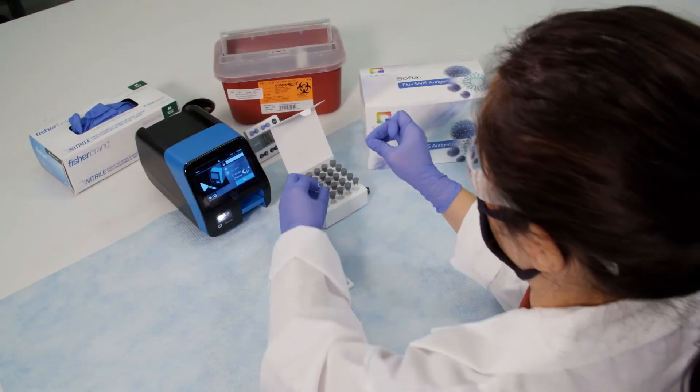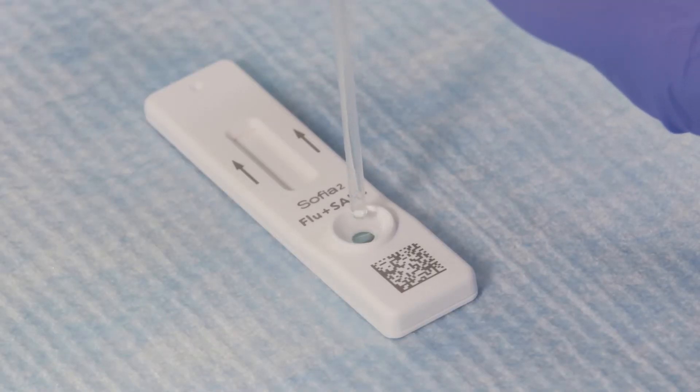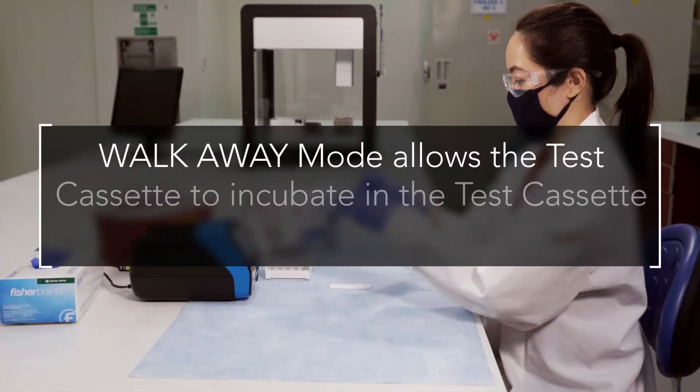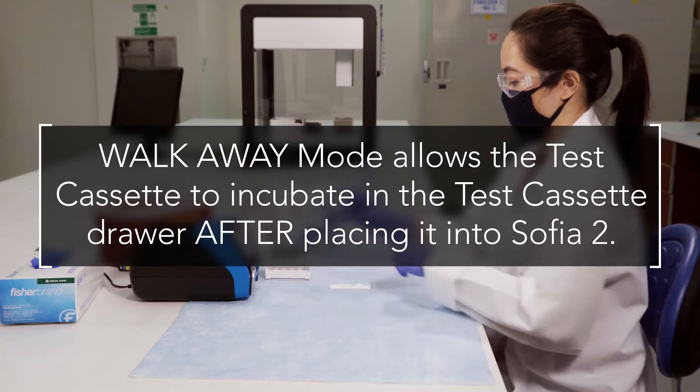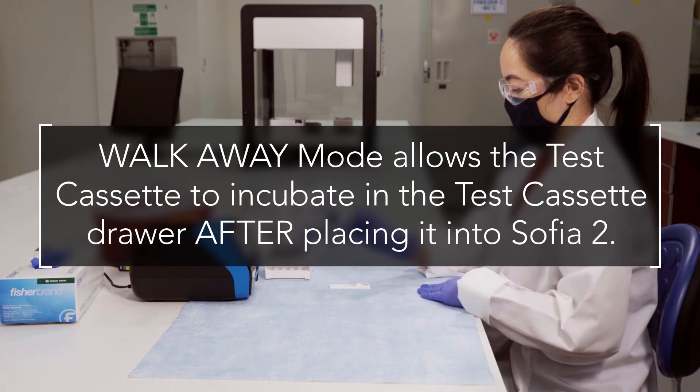Then firmly squeeze the top bulb to empty the contents of the fixed volume pipette into the cassette sample well. In walk-away mode, the test cassette will incubate in the test cassette drawer and SOFIA2 will automatically time the result. SOFIA2 Flu Plus SARS Antigen FIA can produce positive objective results in 15 minutes.